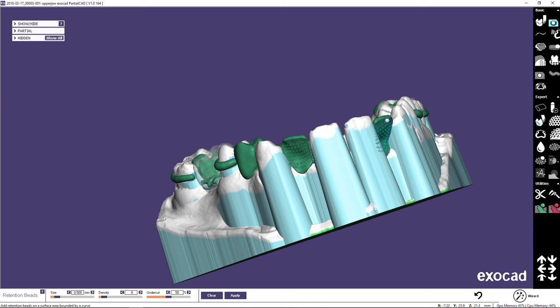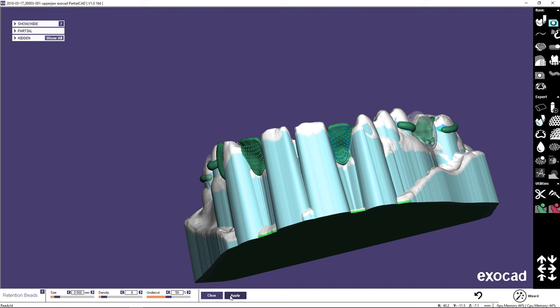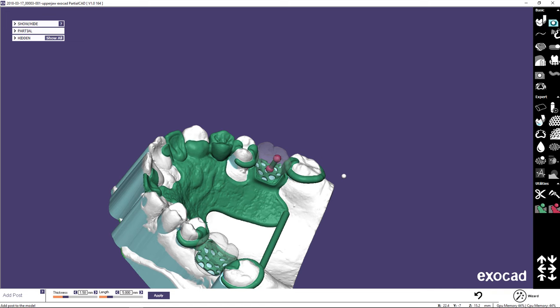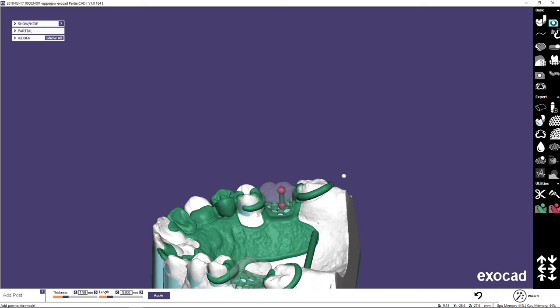Repeat the process on the other tooth. To add a post, select Add Post Tool and click on the model to place the post. Move the position of the post by clicking and dragging the bottom control point. Change the angle of the post with the top point. The thickness and length values can be altered in the bottom menu. Select Apply.